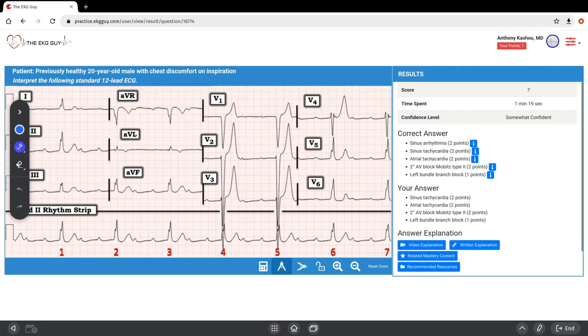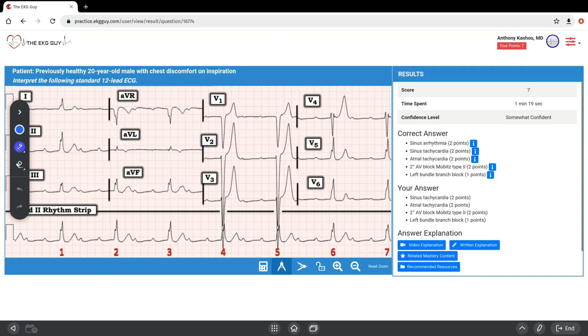It's difficult to make out all the P waves, although we can clearly see two P waves within each R to R interval. Given the P to P interval, it's possible that a third P wave might be hidden within each QRS complex. If this is the case, the atrial rate would be about three times the ventricular rate. The ventricular rate was about 42 beats per minute. Multiply that by three, and you get about 126 beats per minute.